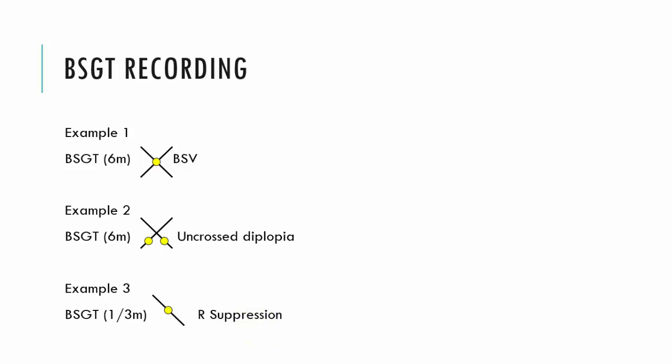Again, just be mindful that in order for you to make the correct interpretation, you will need to be very, very mindful about how you presented the striations to the patient. So how were the Bagolini glasses oriented in front of the patient's eyes?